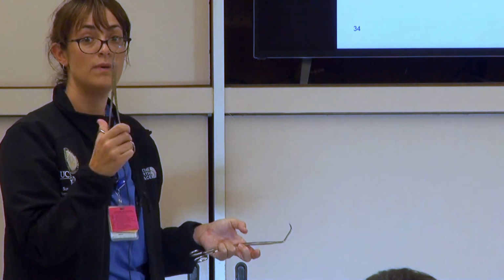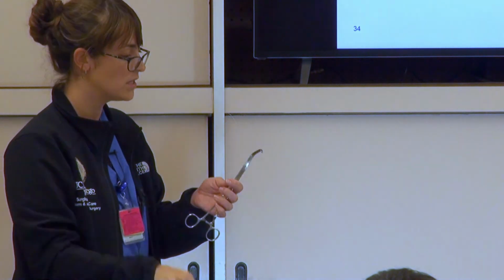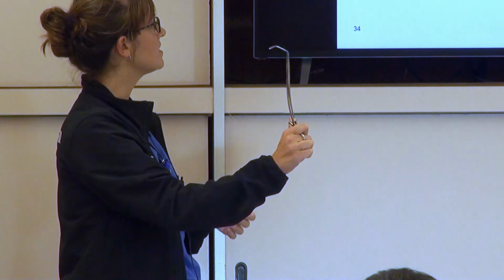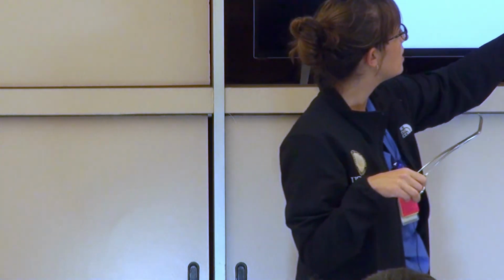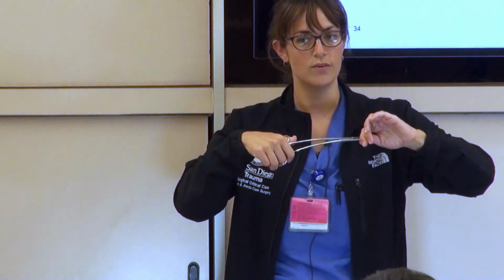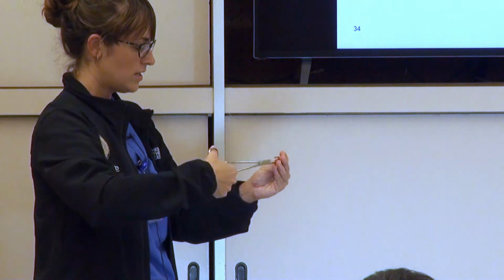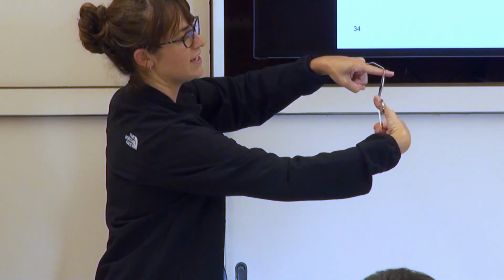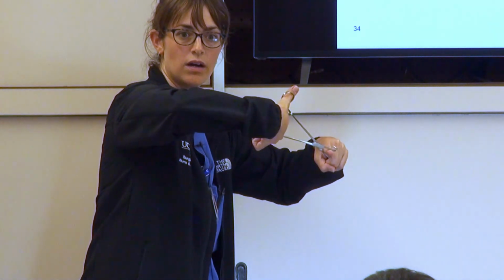You can actually use the DeBakey clamp. This is the cross clamp that you can put across the aorta. You can use this to dissect. Sometimes it's really hard to do that, and so they may ask you for a side biting clamp, which is this guy. This is a Satinsky. There's another version, a Lambert-Kay, which has a little angle on it that makes it nice. Basically, if the aorta is like this, we're putting this in and coming across it like that. And this is easier, because you can almost come directly on it.